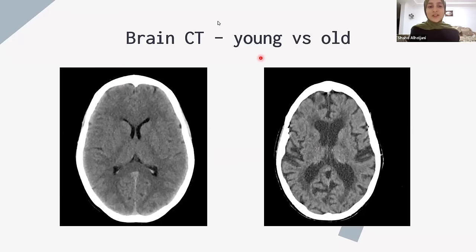Okay, sulci bigger, ventricles are bigger, wider ventricles. Yes, good job. Okay, so you have different things going on when a patient ages. For example, if a patient has Alzheimer's or if the patient is older, the brain structure obviously won't stay the same. Here you can see the biggest change is the ventricles. The ventricles are getting larger. The brain will be shrunken, and then the sulci will be larger. So here you have the enlarged sulci, the large ventricles, and shrinking of the brain itself. All those changes happen when the patient grows older.